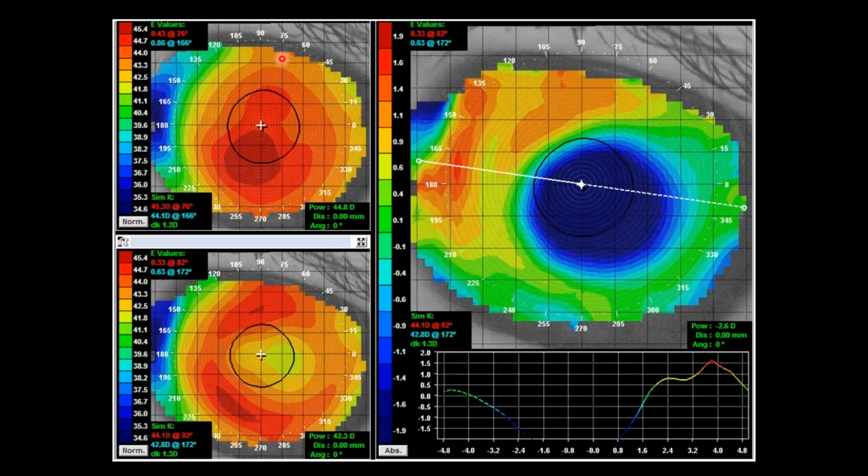Of course we would. We would try to go larger if we needed a larger diameter to drag it more onto the middle. We might go slightly looser in the alignment zone, the landing zone angle, to bring the lens up, to allow more lid force, to possibly center the lens a little better vertically.